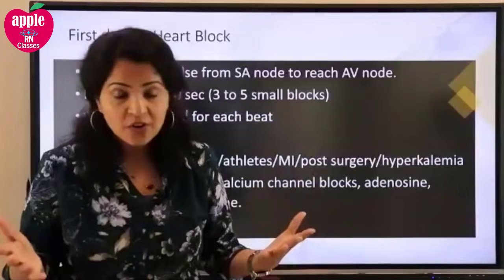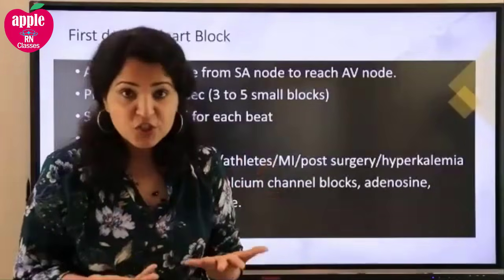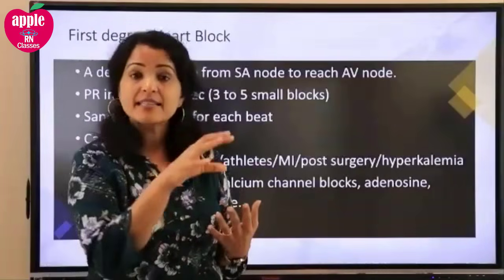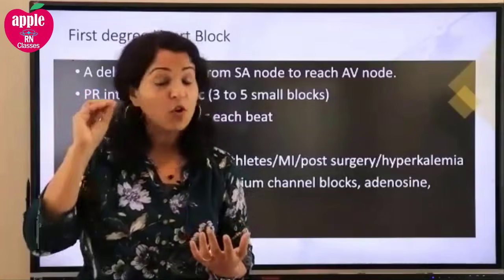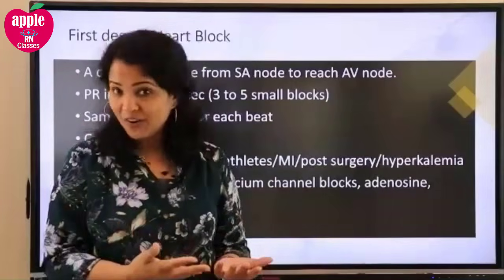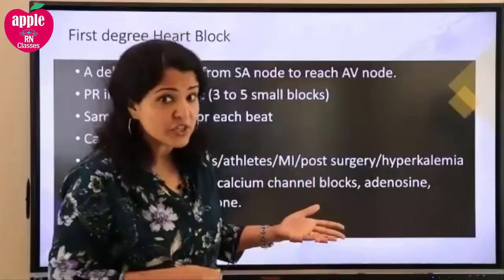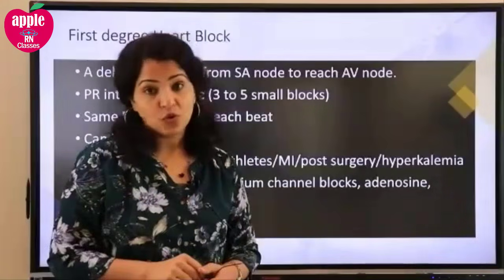How do we know? We have to check the patient. We have to assess the patient. We have to ask the patient. We need to look at the blood work. We need to look at the history. And that's how we figure out, is this something normal or is this something we need to work on? Okay, so all those questions are important to ask the patient. Do not assume that things are okay because it's just first degree heart block. Maybe it's okay if the patient is not having any symptoms or any history or taking any medication, but if there is anything with it, then we have to act on it.